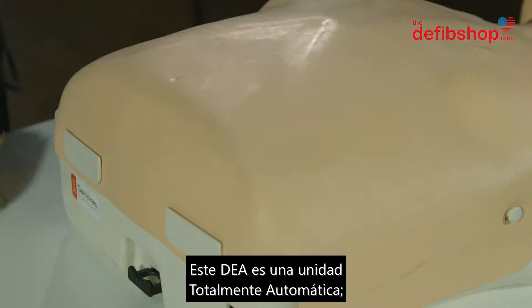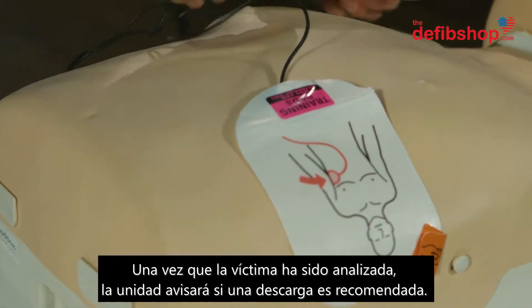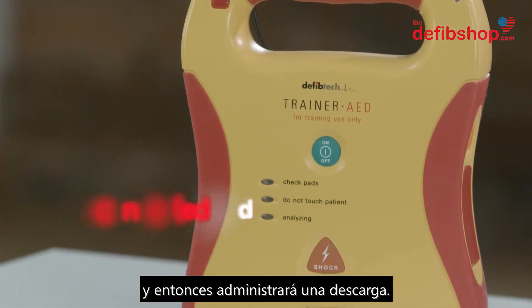This AED is a fully automatic unit. It will advise if a shock is needed after analyzing the patient. Once the victim has been analyzed and a shock is advised, the unit will warn the user to stand clear and will then deliver a shock.